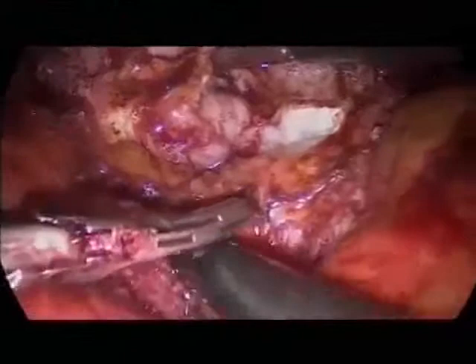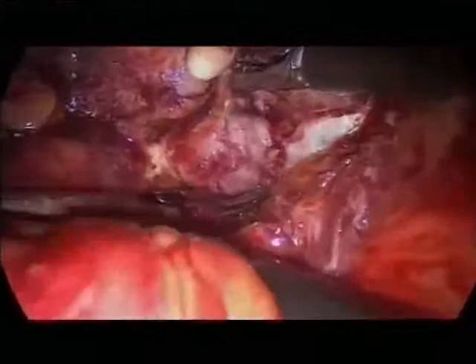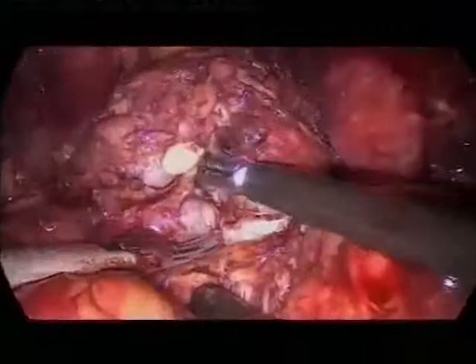The most important thing is here's the bladder neck, and you go straight forward in the posterior direction. There's no risk of injury to the rectum, just straight forward. The biggest mistake you can make is to dissect too tangentially here, and then you would end up in the prostate, and that's what we don't want to have.